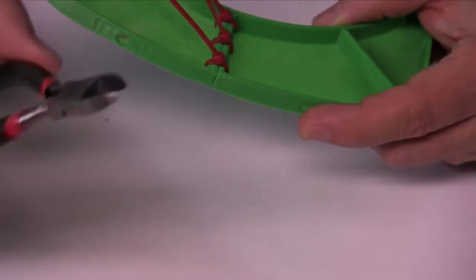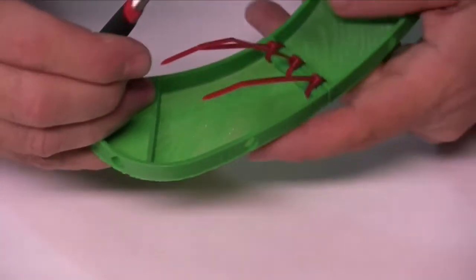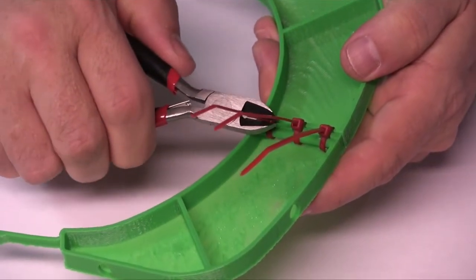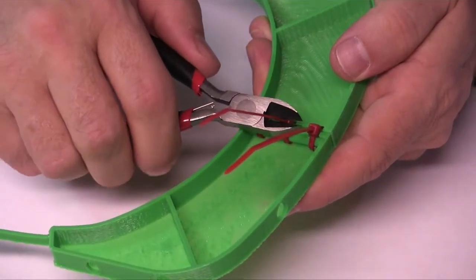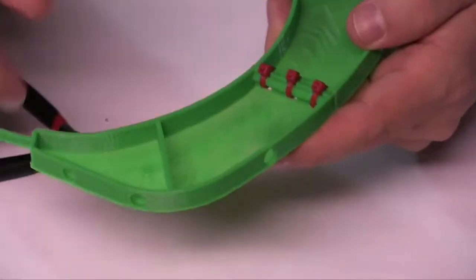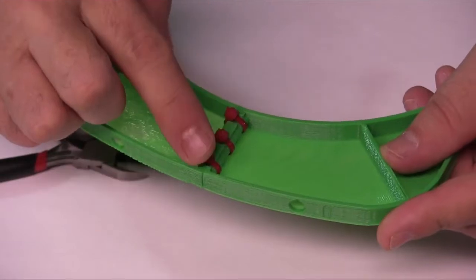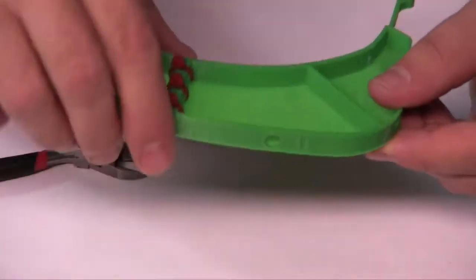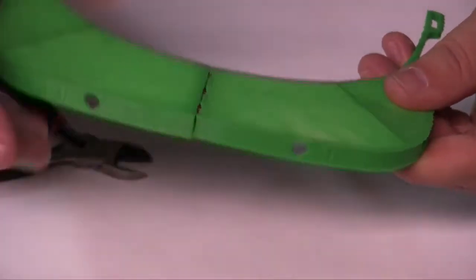And then if you have a handy dandy little clipper, like this pair of snippers here, you go ahead and you cut off the extensions of each one of these. They usually fly away. Look at that. That went right across the room. You have to clean up after. That's probably the funnest part of this whole thing. And so there we have our shield put together with the three zip ties. So now this is ready for us to be able to attach. We'll turn it over. And this is where we'll attach the plastic shield that protects our workers.